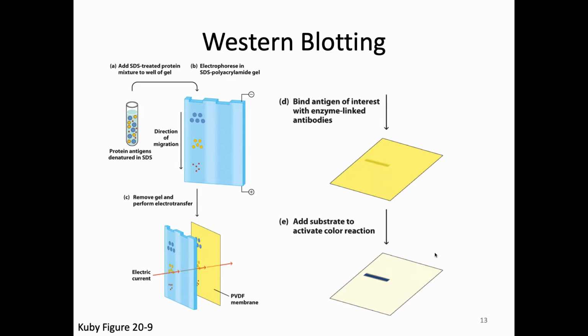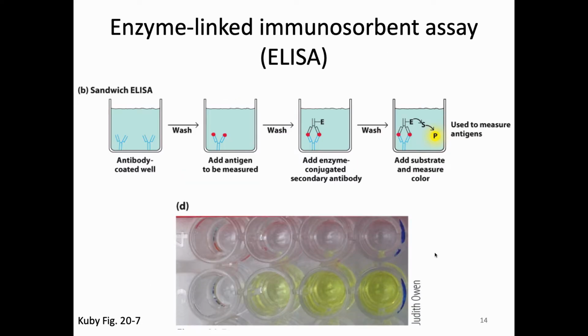You could also imagine that you don't even have that. And so you could do the exact same thing, but with a different format of your antigen, where you might have your antigen in solution. We are going to do this later in the semester to help us measure a cytokine that was produced by a cell. And so in the lab, the antigen will be the cytokine. And we will have a tube of stuff the cell made, of liquid the cell made, and we want to know, is the cytokine in there or not, and how much.